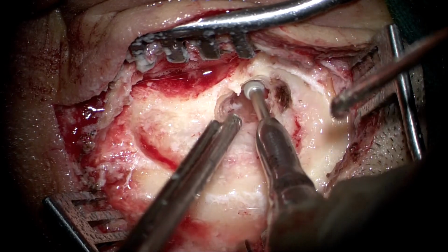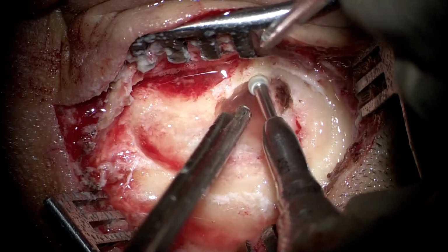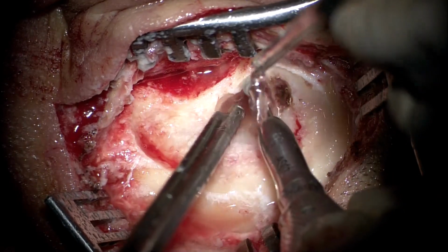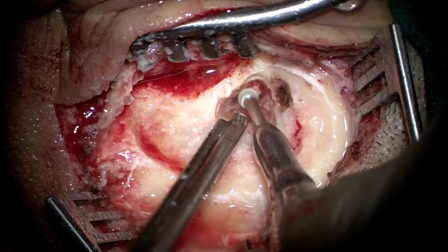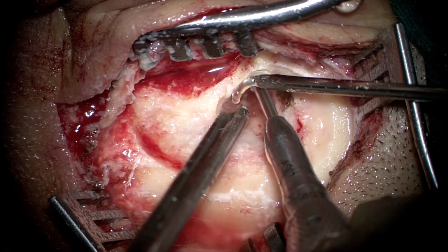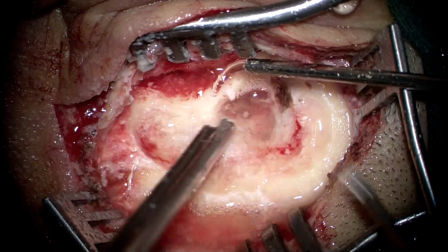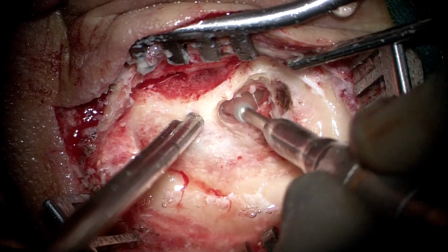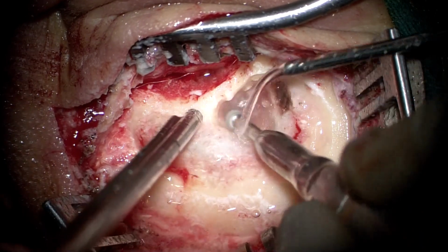We see here that the antrum is about to be opened. At the superior lateral level, we can already see that the dura has been reached, where we have done some coagulation, and we really cannot be drilling much more above that on a medial aspect, but laterally we can drill more and expose some more dural plate. Here we are making the initial attempts to thin down the posterior canal wall, first superiorly, and then we would need to thin it down inferiorly so as to gain space between the posterior canal wall and the sigmoid sinus, which right now, because of the anteriorly positioned sinus, looks difficult.